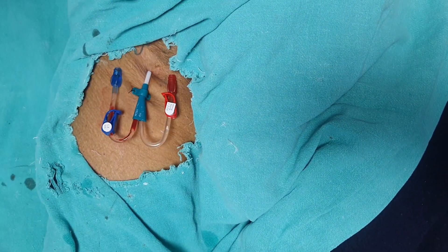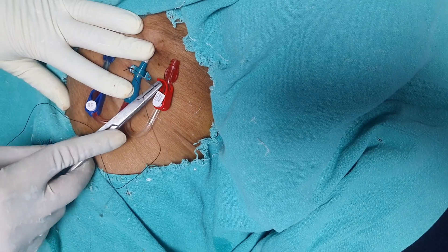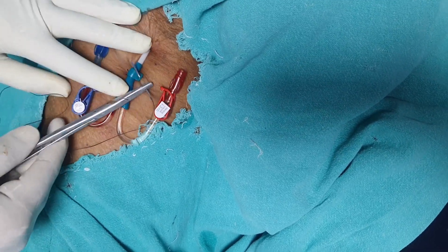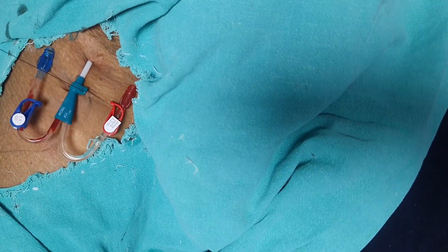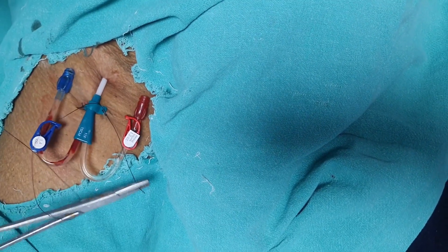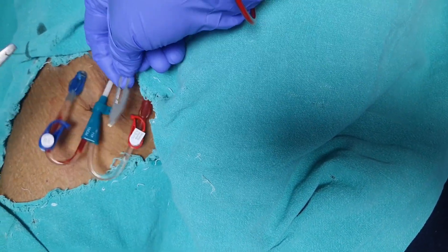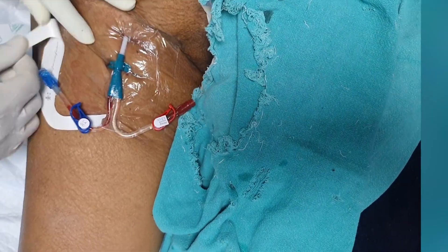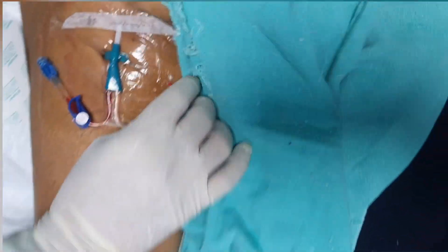The main problem with a femoral catheter is that it can cause deep vein thrombosis, which can rarely embolize to the pulmonary artery and can be fatal. In most cases we should avoid inserting a central line in the femoral area because it is a dirty area and can cause infection. Now our suturing is completed. We will paste a Tegaderm transparent sheet and put a sticker noting the date of insertion.